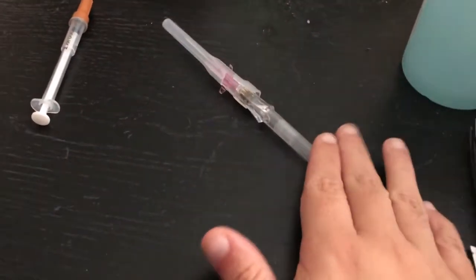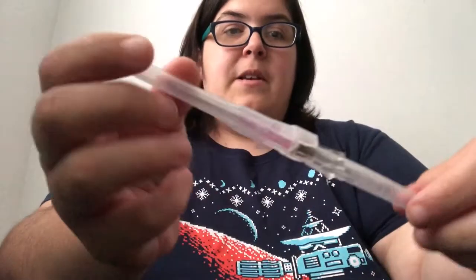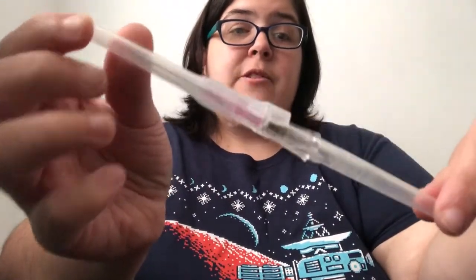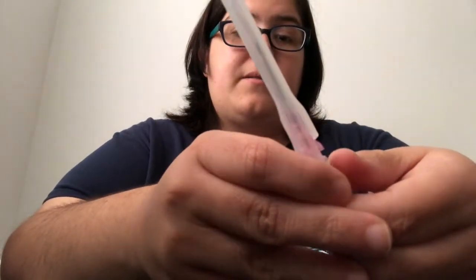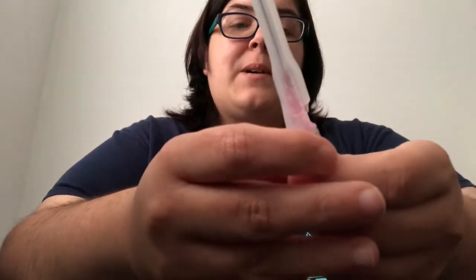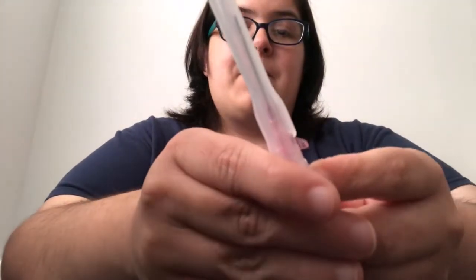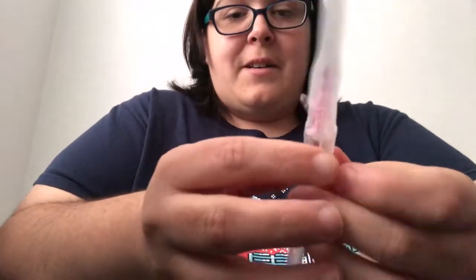Now I'm going to show you this needle and the cool feature that it has. Okay, so this is actually for starting IVs. Now let me take this apart here. I want to make sure that I don't hit that little safety button, because that will kind of ruin what I'm trying to show you guys. Let's see if it'll come off here.